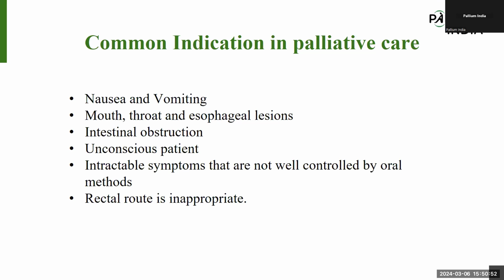Any other questions? So we can give it in home care settings also. One question is there: mainly, it is preferable in home care settings, right? No, in our settings, 95% of patients are getting subcutaneous fluid. When you come to Pallium India, you can see we have an inpatient unit here, and most of our patients are on subcutaneous infusion.